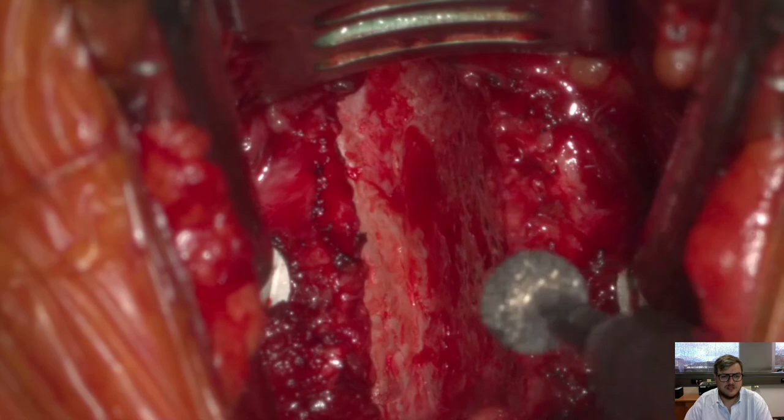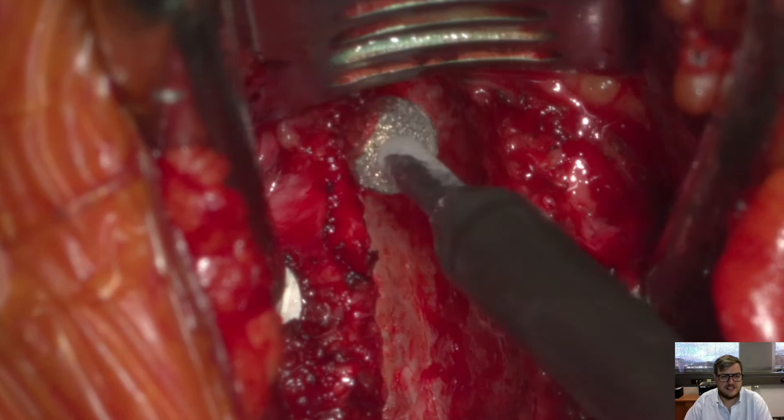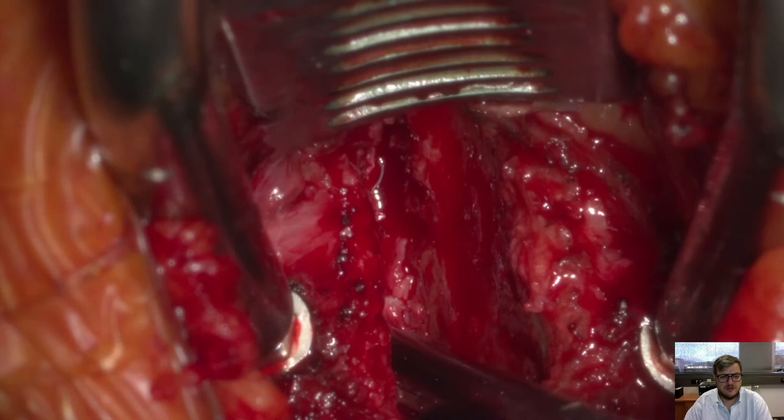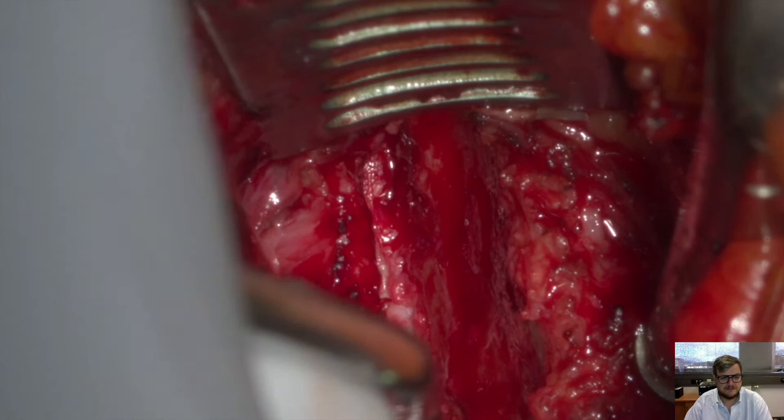Now it's back centered towards the posterior ligament. The fellow doing the surgery is drilling the lower part of the lower vertebra, and also removing the posterior ligament with several punches.